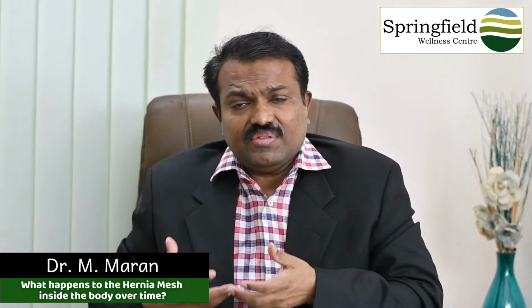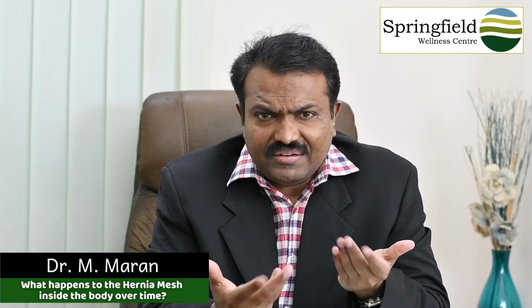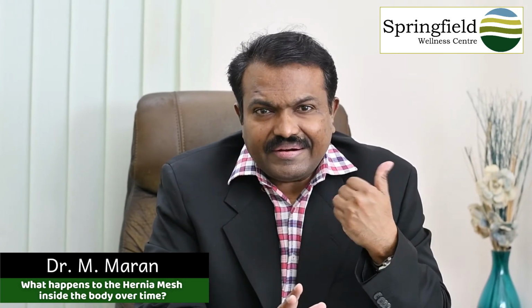Even the biggest mesh usually weighs less than 10 to 20 grams, so you don't have to worry about the heaviness of the mesh. Mostly meshes are broadly of two types: absorbable and non-absorbable. Absorbable meshes will be there in the body for some time, then get absorbed. But nowadays these absorbable meshes are not used much, only in very rare cases.